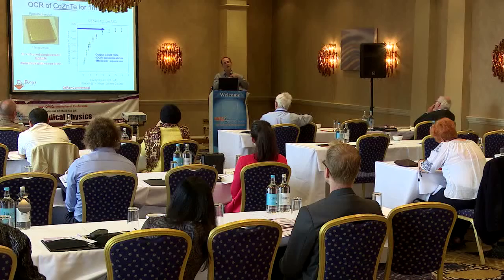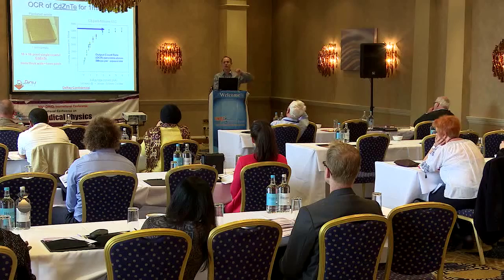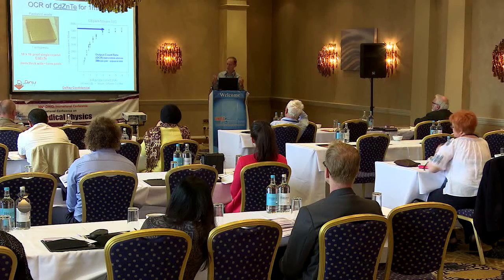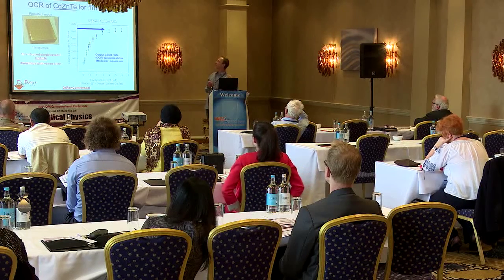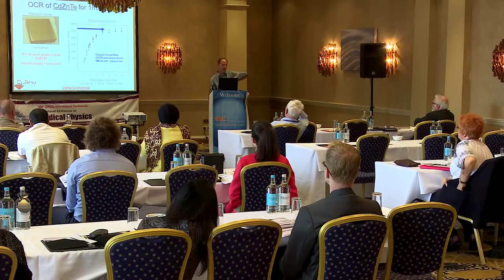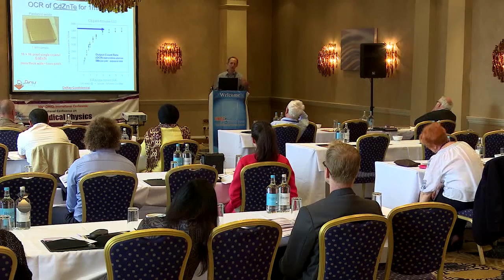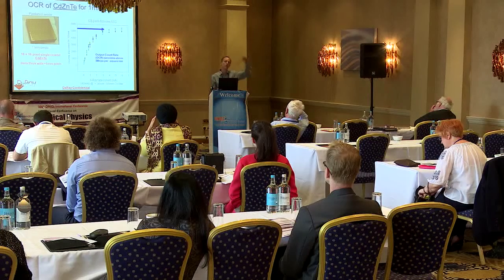The cadmium telluride and cadmium zinc telluride have a different bulk resistivity, so there is a much larger dark current in cadmium telluride. Because of this, when you see SPECT and PET systems being developed using cadmium zinc telluride, which is also often called CZT, cadmium telluride cannot be used for those applications. That's because the peaking time to integrate the charge from each X-ray that comes in is sufficiently long that the dark current that comes from the thermal current contributes to the signal.